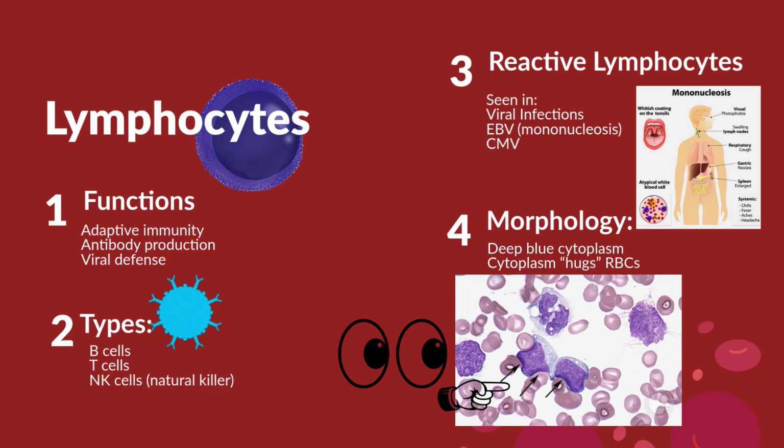There's no one-eyed bandit in there, you can't see the cyclops eye. Remember, mature cells equal clumped chromatin. Immature cells have fine chromatin. The cytoplasm usually is light blue, scanty, and forms a thin border around the nucleus. A reactive lymphocyte occurs when it's activated during a viral infection.